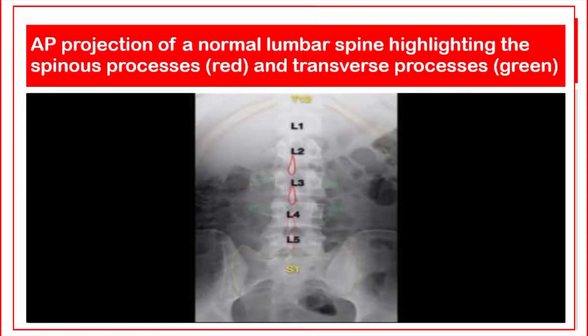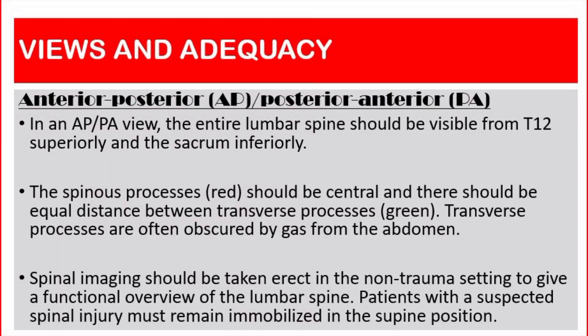The second view is anterior-posterior or posterior-anterior. In this view, the entire lumbar spine should be visible from T12 superiorly and the sacrum inferiorly. The spinous process should be central and there should be equal distance between transverse processes. Transverse processes are often obscured by gas from the abdomen. Spinal imaging should be taken erect in the non-trauma setting to give a functional overview of the lumbar spine.